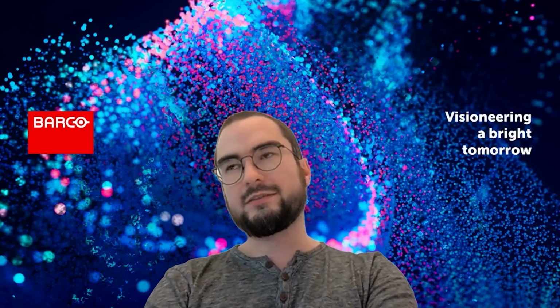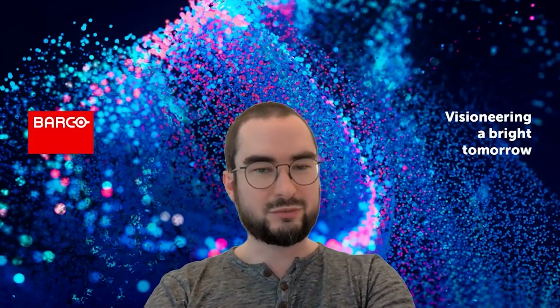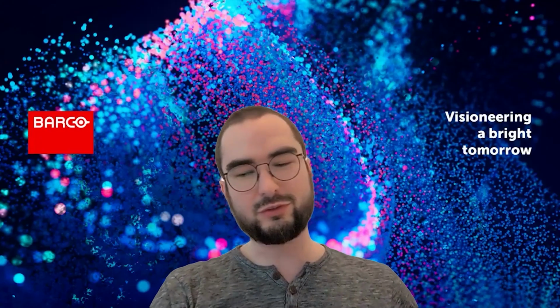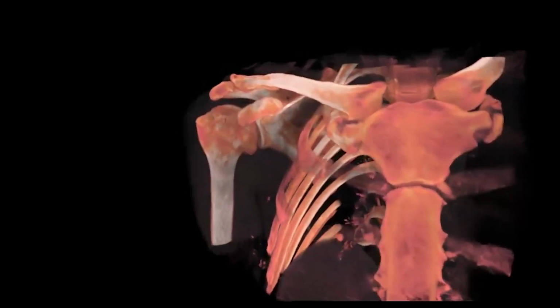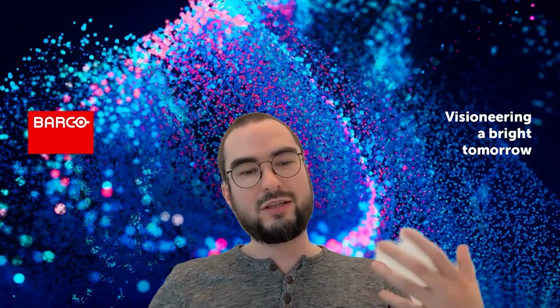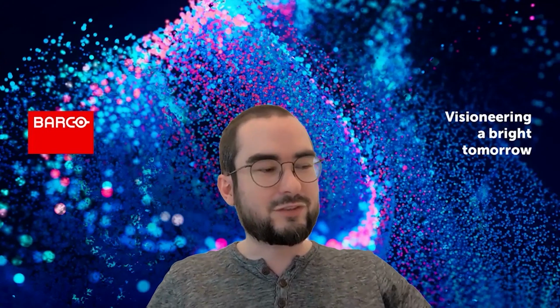I think this question is great, but it's also a bit limiting, because when it comes to clinical imaging, the root of the content is always 3D. The CTs and the MRIs, okay, they're flat slices, but you can always stack all the slices and you have your representation of your body. So it is always 3D content. So in that way, where it has the biggest impact is a tough decision to make.